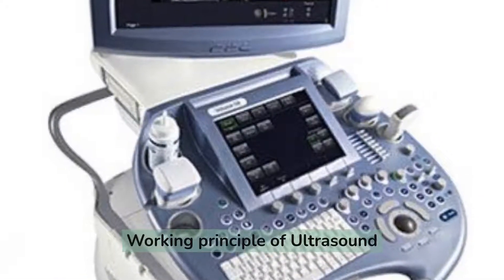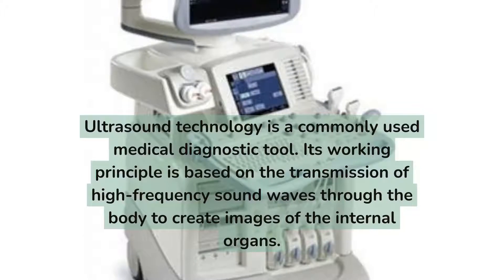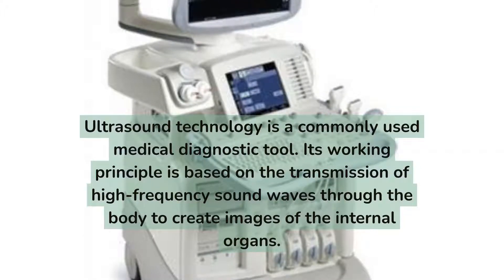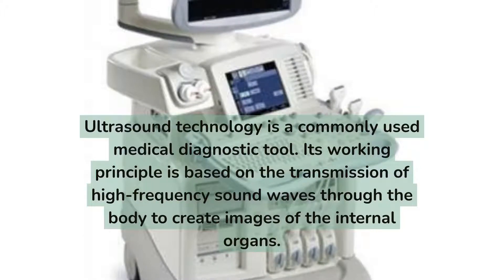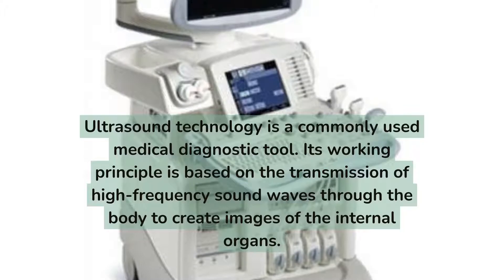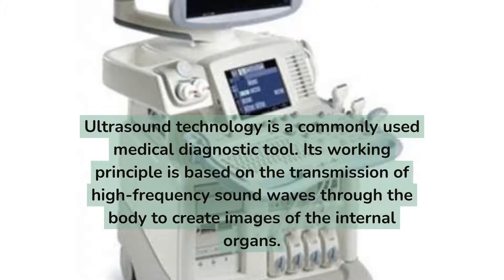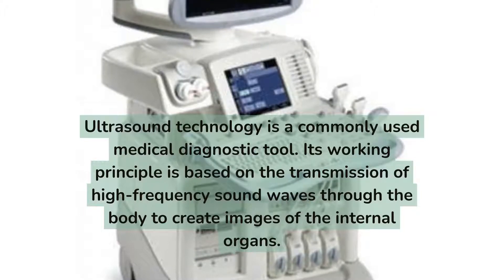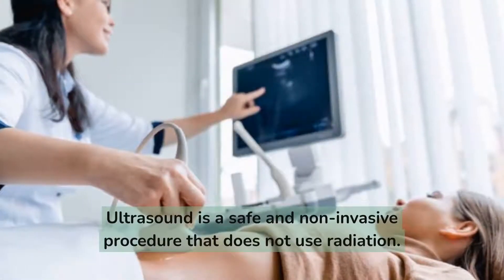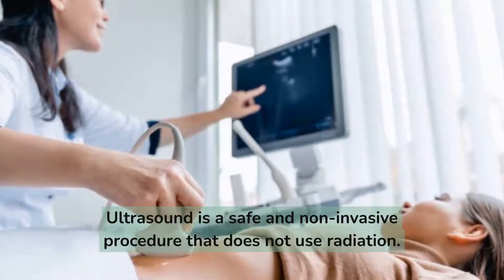Working principle of ultrasound. Ultrasound technology is a commonly used medical diagnostic tool. Its working principle is based on the transmission of high-frequency sound waves through the body to create images of the internal organs. Ultrasound is a safe and non-invasive procedure that does not use radiation.